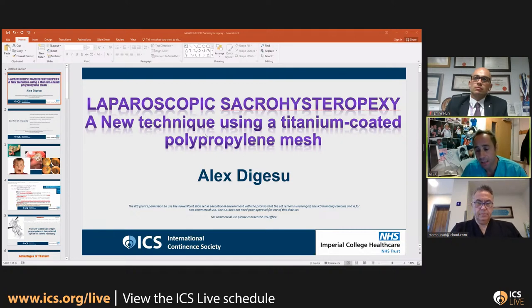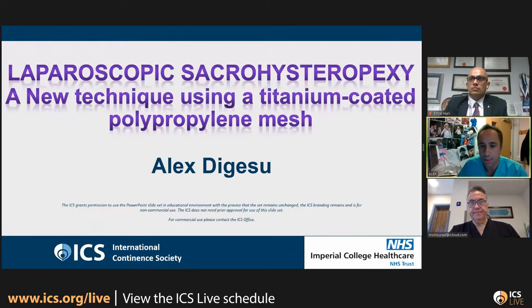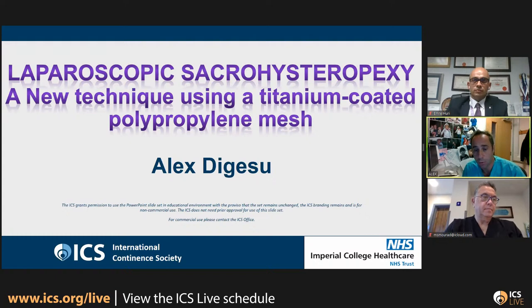In the next 15 minutes, I'm going to show the way I do this technique to treat uterine prolapse by using a monofilament polypropylene tape covered by titanium to suspend the uterus to the sacral promontory without burying the mesh underneath the peritoneum. Therefore, I'm going to explain the rationale why I feel it is a safe surgical approach not to bury the mesh underneath the peritoneum.